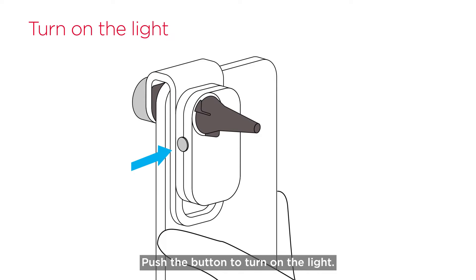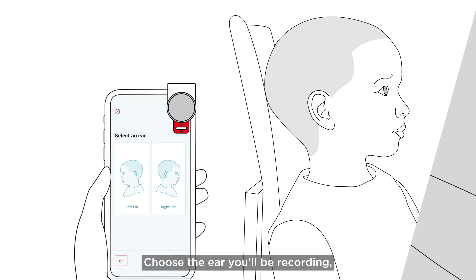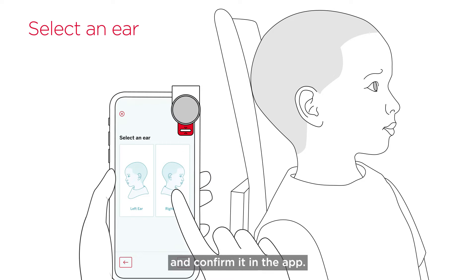Push the button to turn on the light. Point it at your hand to test that it's working. Choose the ear you'll be recording and confirm it in the app.